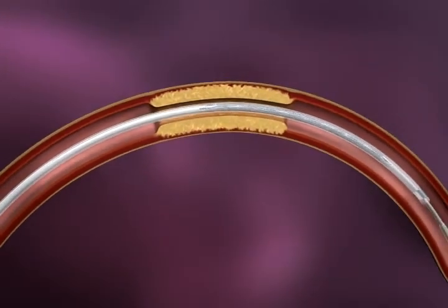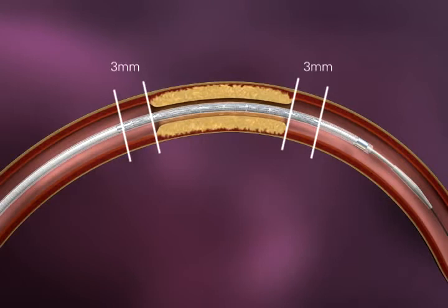Slightly withdraw the delivery system until the stent is directly aligned with the lesion. The stent should extend approximately 3 mm over each side of the lesion. The stent is now ready to deploy.